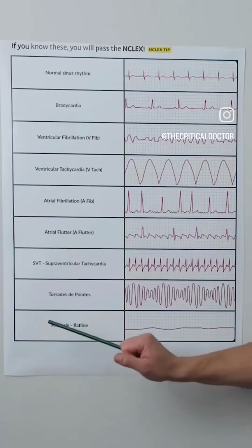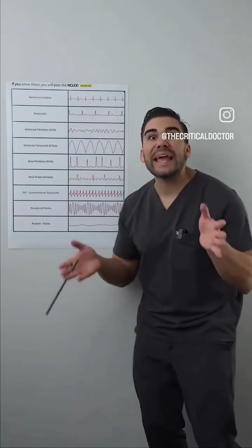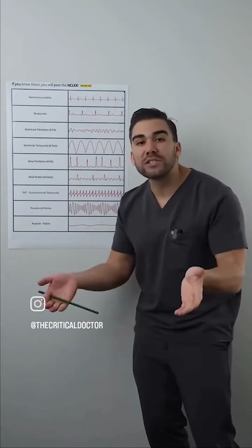Now very lastly is asystole. This is our flat line. Remember, you can never shock asystole. The best thing we can do is get our hands to pump on the chest and also give epinephrine.